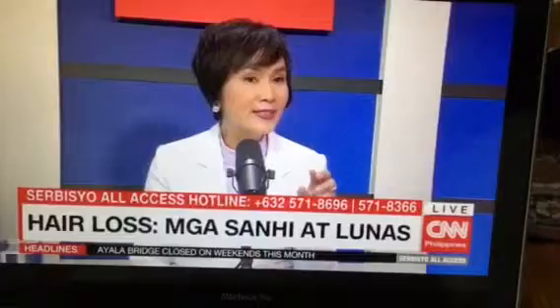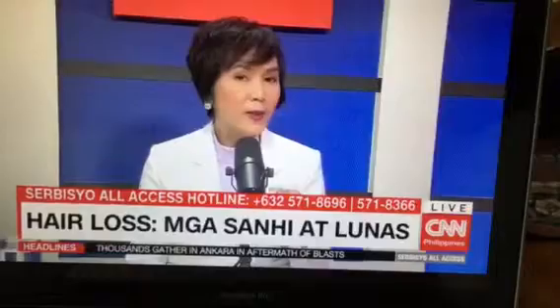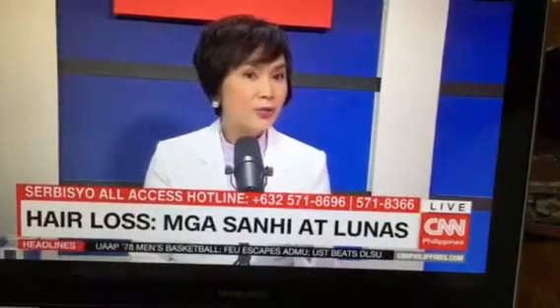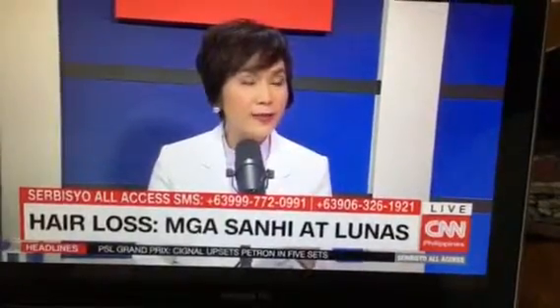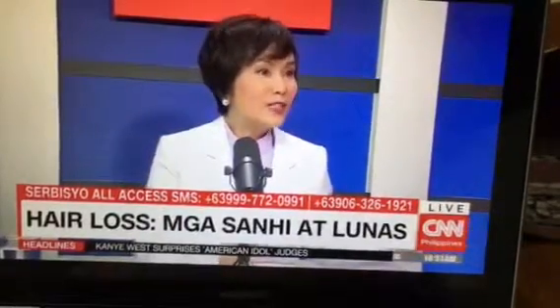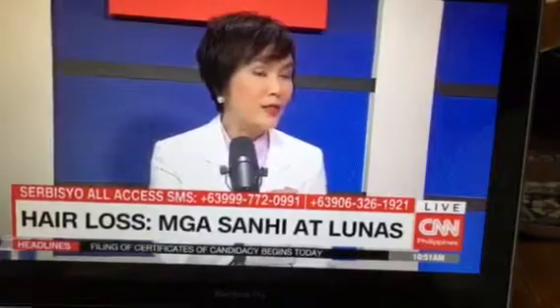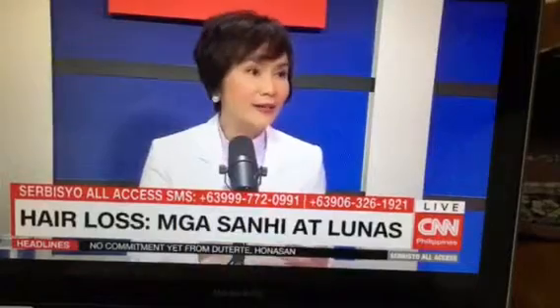Okay, it just fulfills one part, no? And then there are pros and cons. On my part, I use a special instrument also to do the same extraction as the robot can do. So it's actually no difference except that you have this big machine na instead of the physician doing the extraction, which is so difficult, because to be able to perform the extraction of the follicles, you have to really have the experience and the skills and the knowledge.